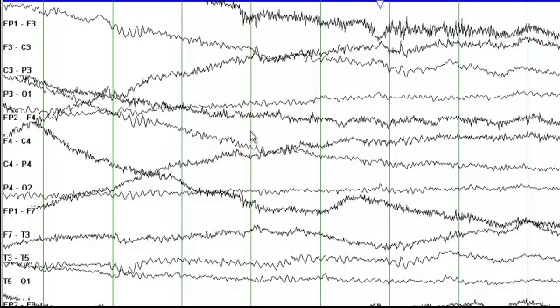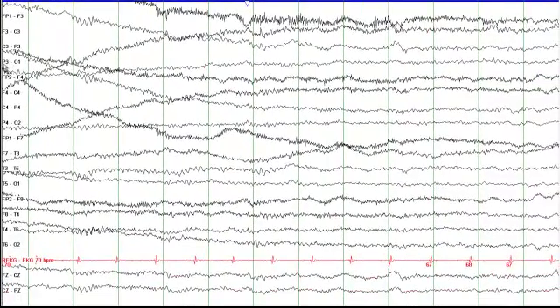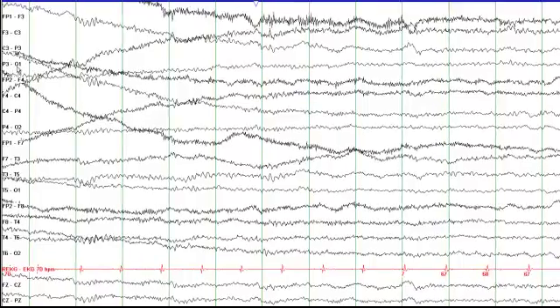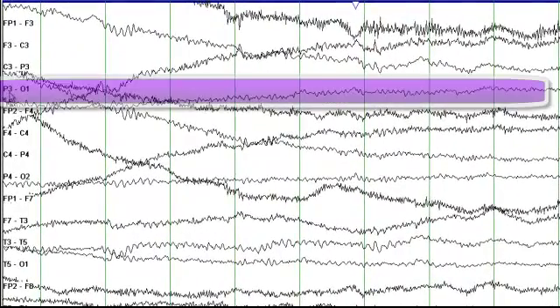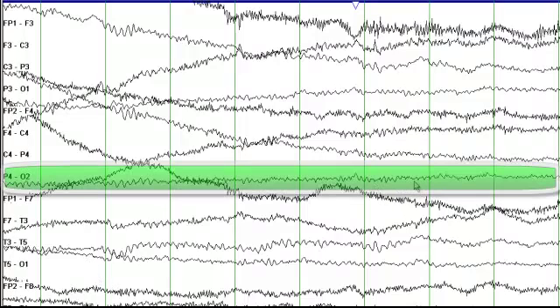These green lines are separated by one second. Looking at the posterior channel, P3O1 is the left side — looking at the potential difference between P3 and O1 — you see some alpha frequencies. Likewise, when you look at P4O2 you see some alpha to beta frequencies. There is a lot of muscle artifact here.